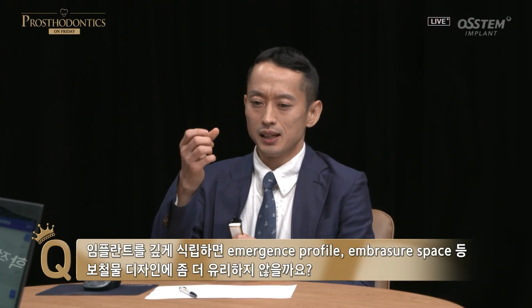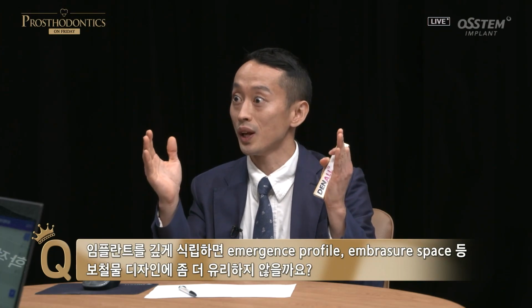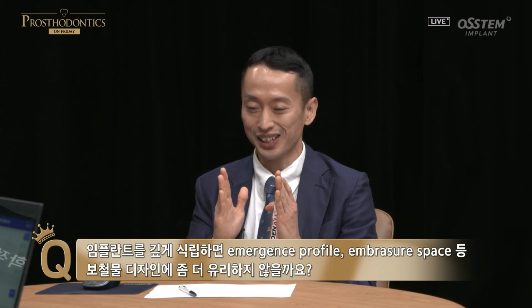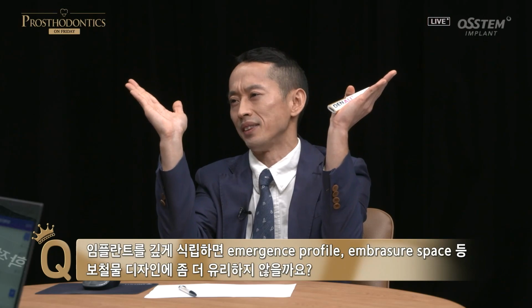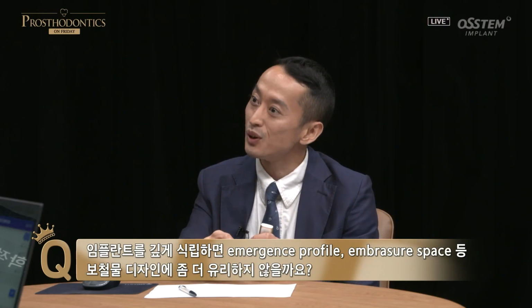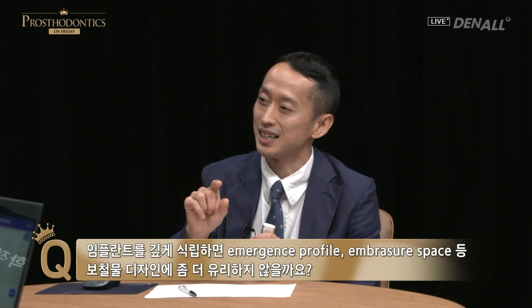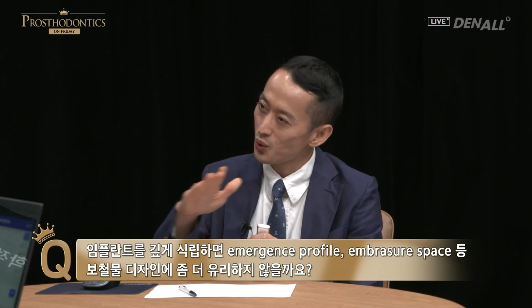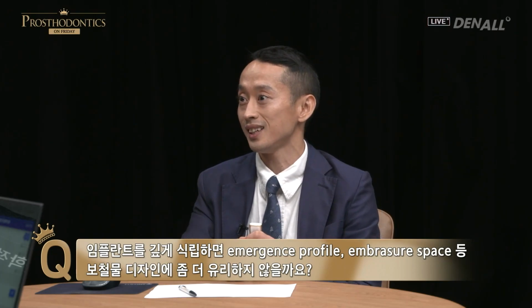Because if you just place it deep, at times, if the alveolar bone thickness on top of platform is thick, it is not resorbed automatically. And when you make abutment, it may be narrow in the lower side and it becomes much wider on the top. Or even if you have placed it deep, if you look at the patient's oral cavity, the vertical space may be lacking because there's not been any gingival resorption. In this case, remove alveolar bone from the start and place the implant deep. I think that is the best way to go.